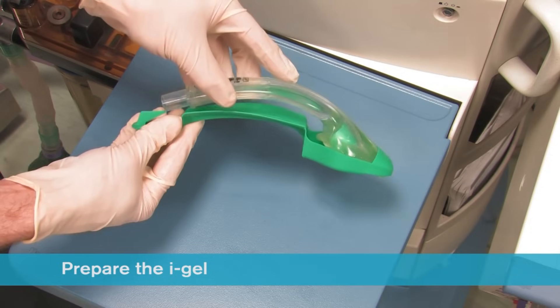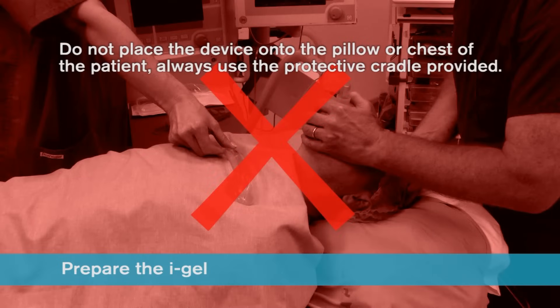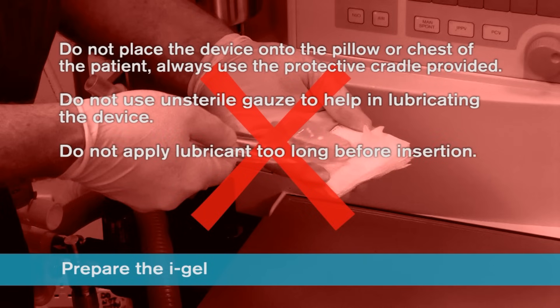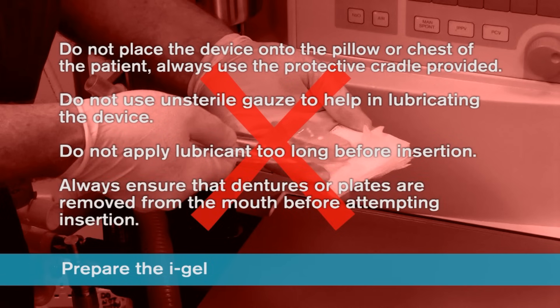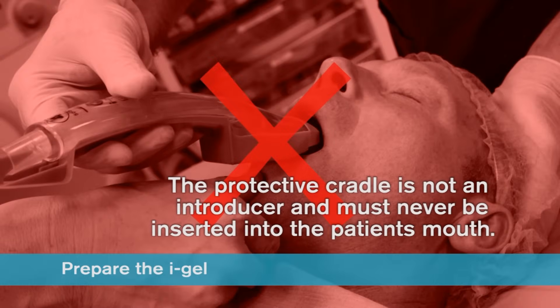Place the iGel back into the cradle in preparation for insertion. Do not place the device onto the pillow or chest of the patient and always use the protective cradle provided. Do not use unsterilised gauze to help in lubricating the device. Do not apply lubricant too long before insertion. Always ensure dentures or plates are removed from the mouth before attempting insertion. The iGel must always be separated from the cradle prior to use, and the protective cradle must never be inserted into the patient's mouth.